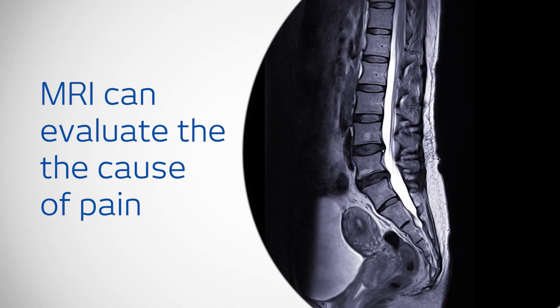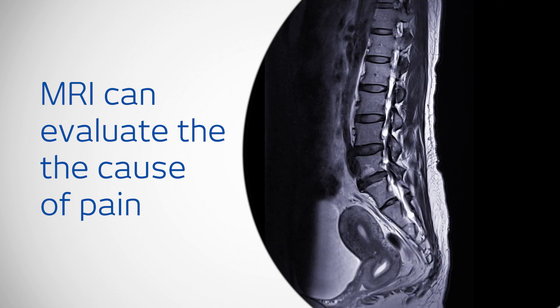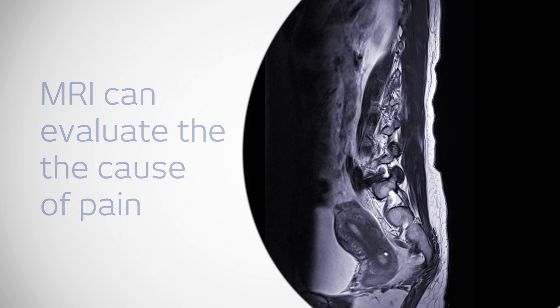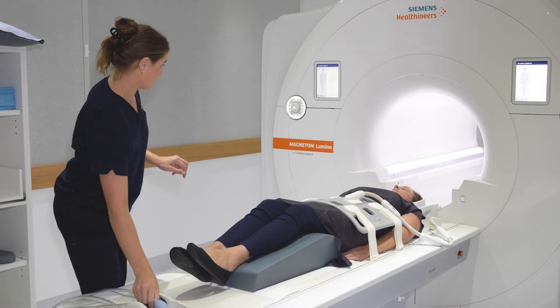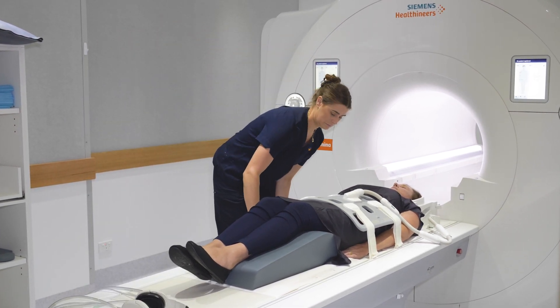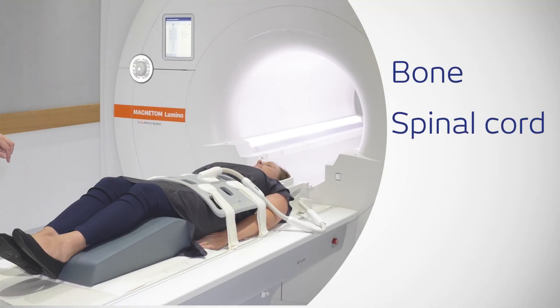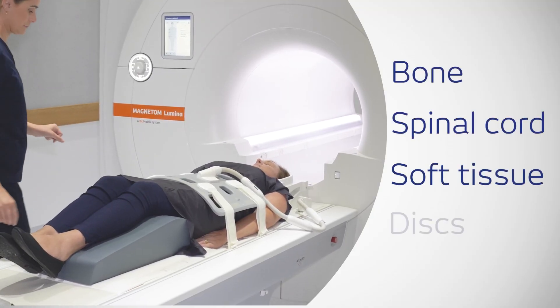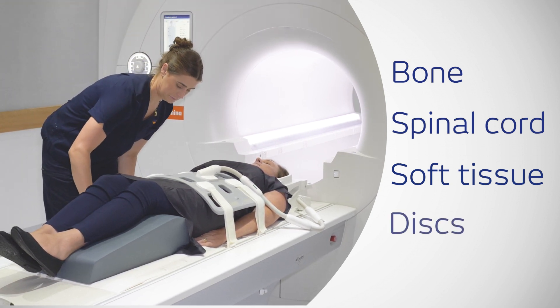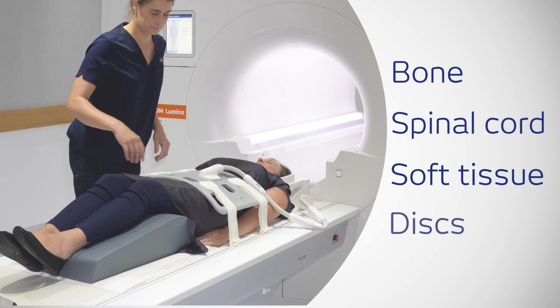Magnetic resonance imaging, or MRI, of the lumbar spine is one of the most useful tools for evaluating the cause of lower back pain. It uses strong magnetic fields to produce images of the lumbar spine, identifying bone, spinal cord and nerves, soft tissue and intervertebral discs. This detailed information helps to accurately diagnose many conditions that affect the lumbar spine.